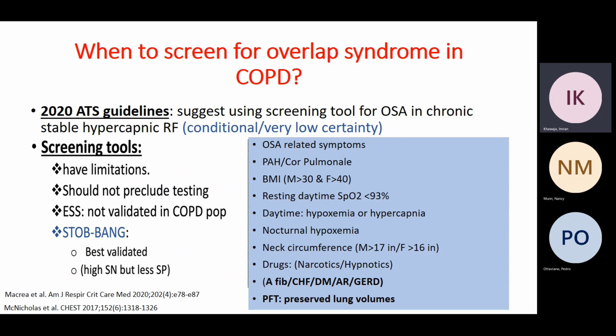But if you want to use what Dr. Megri is saying, like BiPAP ST, and then maybe he can decide about the IPAP, but the EPAP will be something that you have to carefully select in order to overcome your resistance. Because if you have sleep apnea that you're not treating, it doesn't matter how much IPAP you give, your ventilation is going to be compromised because you're not giving enough PEEP to overcome the upper airway resistance.